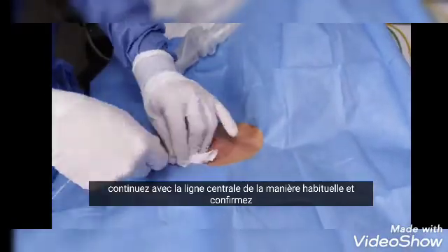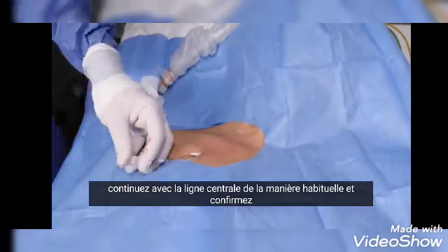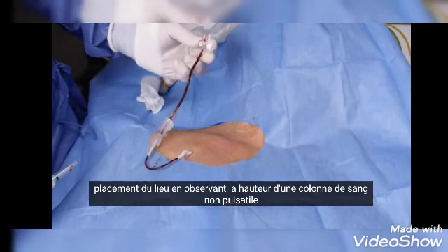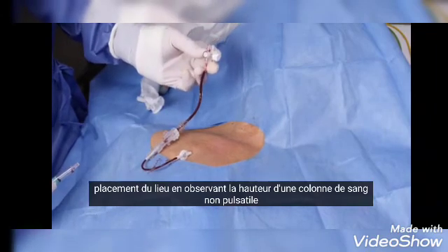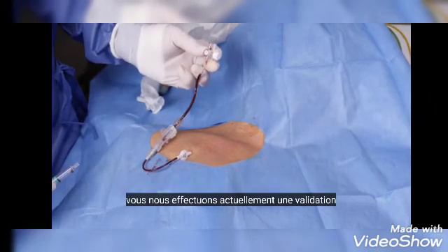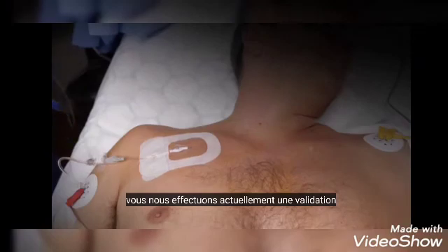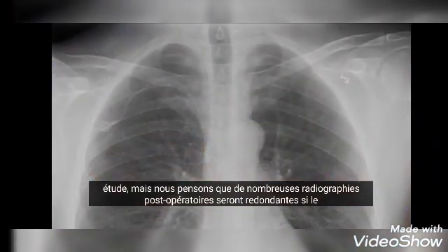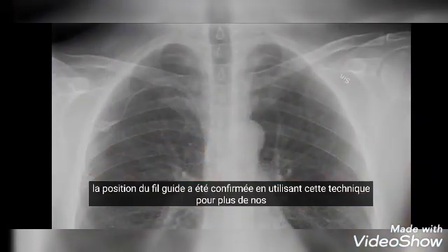Proceed with the central line in the usual manner and further confirm venous placement by observing the height of a non-pulsatile blood column. We are currently performing a validation study, but we believe many post-procedure x-rays will be redundant if the guide wire position has been confirmed using this technique.